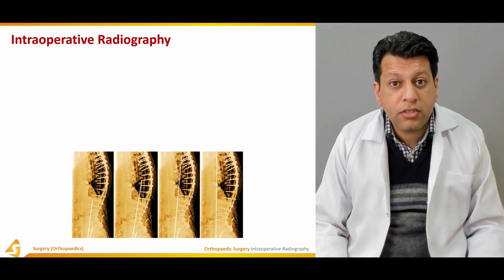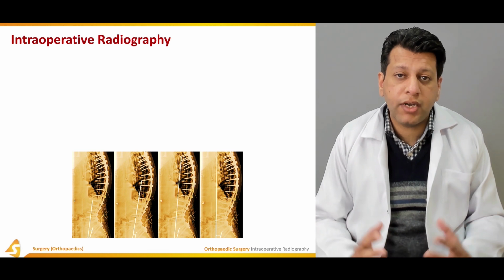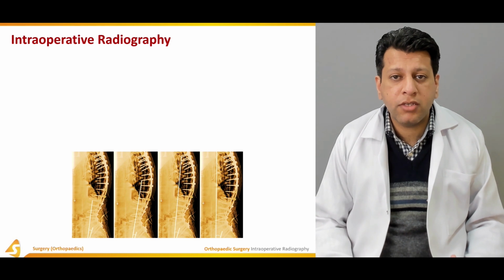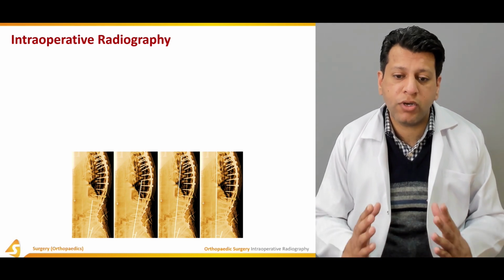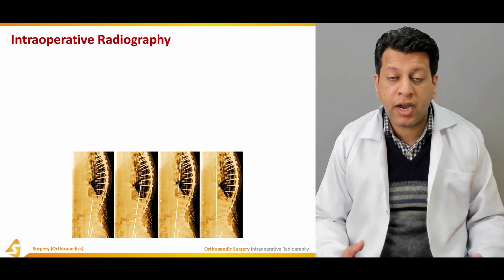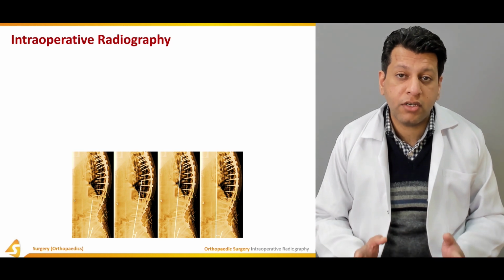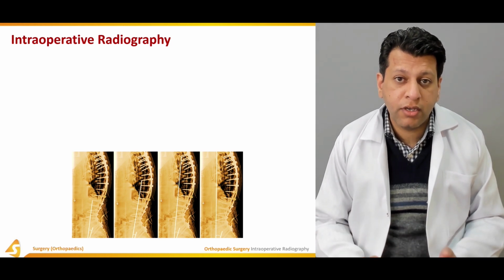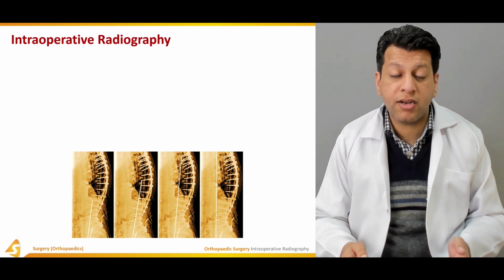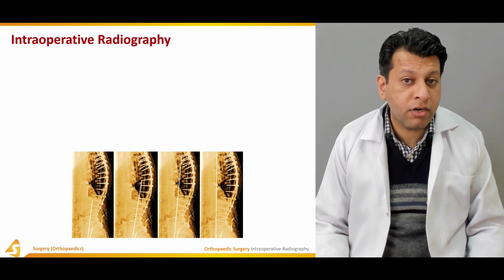As you know, spine surgery is a very complicated surgery. It involves needing x-rays from multiple planes. Usually during a spine surgery, two fluoroscopes are used, one showing the image in AP view and one showing the image in the lateral view at the same time. So the surgeon is very sure that when putting the pedicle screws in, they are only going towards the pedicles or the lateral masses. They are not entering the spinal canal, which may eventually damage the spinal cord.